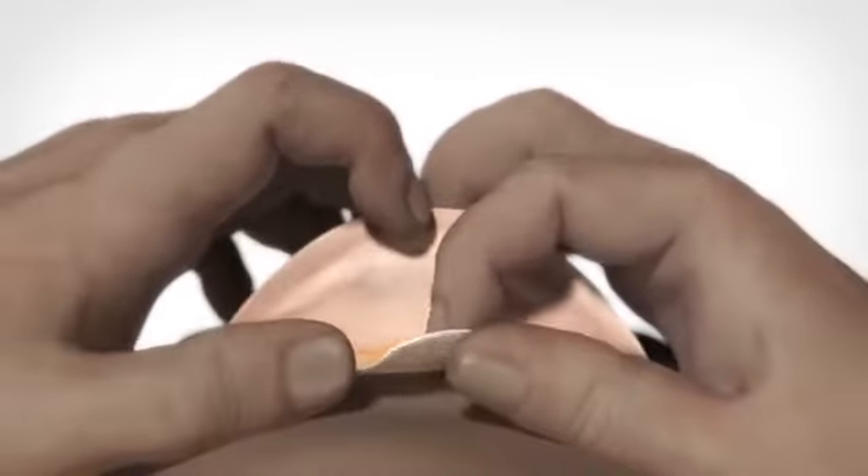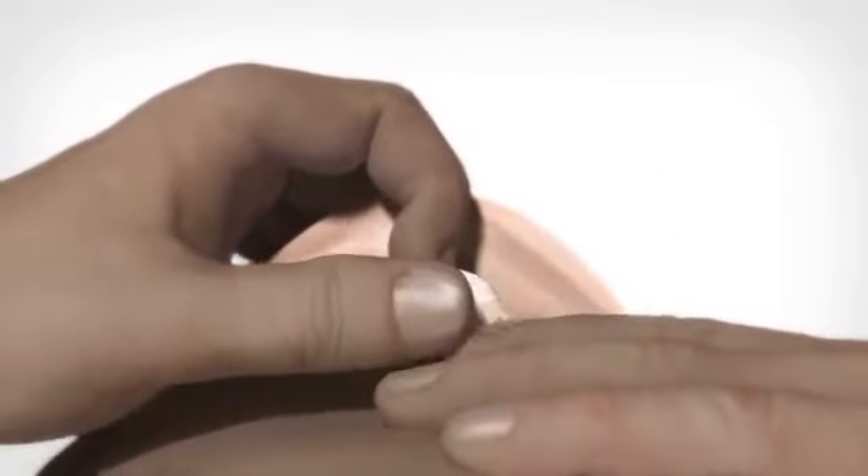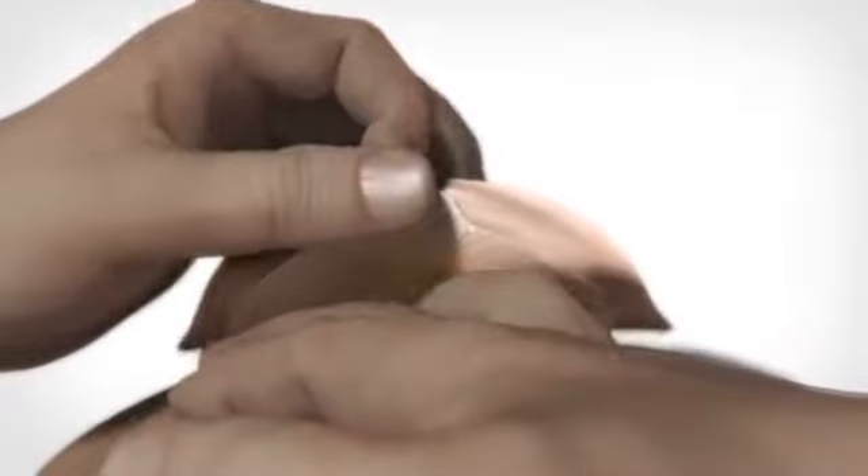To remove the bag, grasp the white tab on the adhesive and gently pull the bag away from the skin. Apply light pressure on the skin with your free hand as you peel the bag downwards.